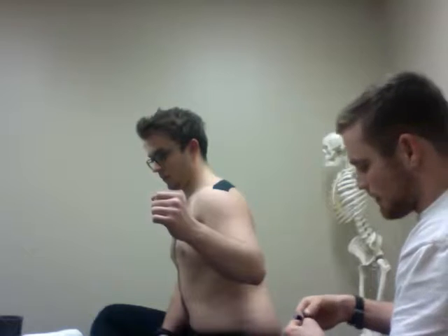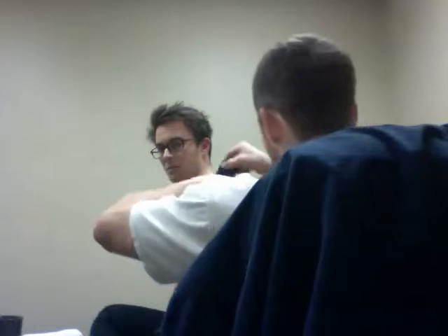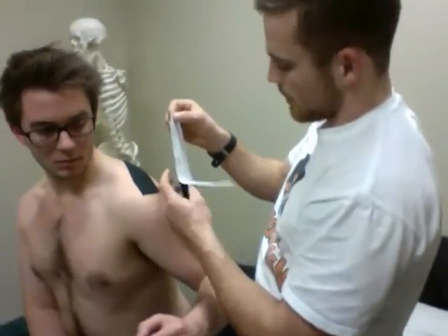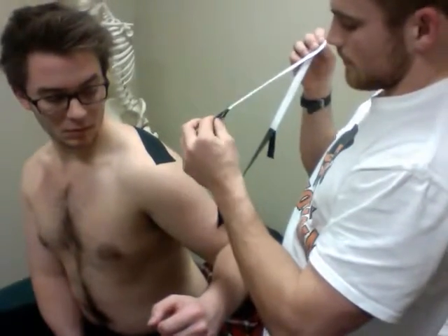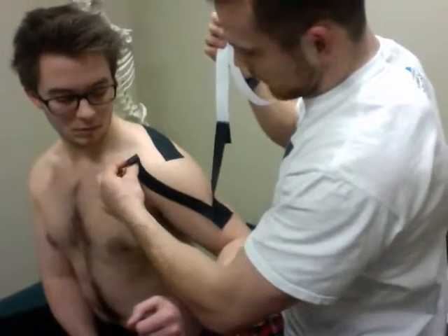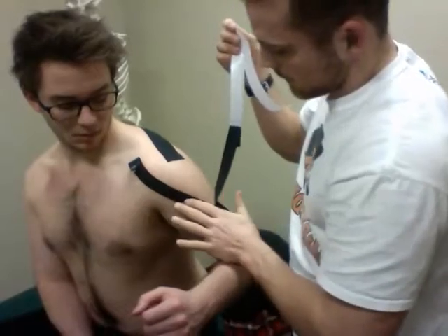Again, this is going to be paper-off tension. This is going to go up and around the anterior shoulder. I did get a little long here, but that's alright — we can cut that off. Again, this is paper-off tension.